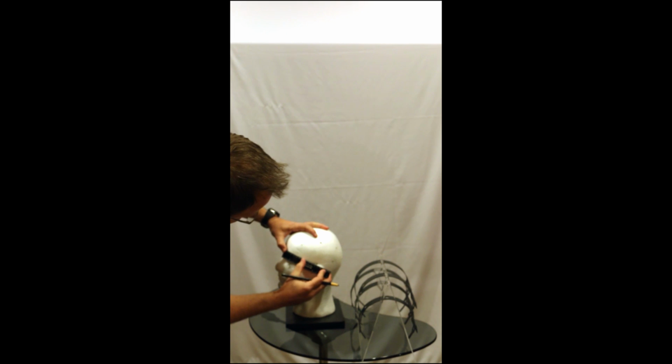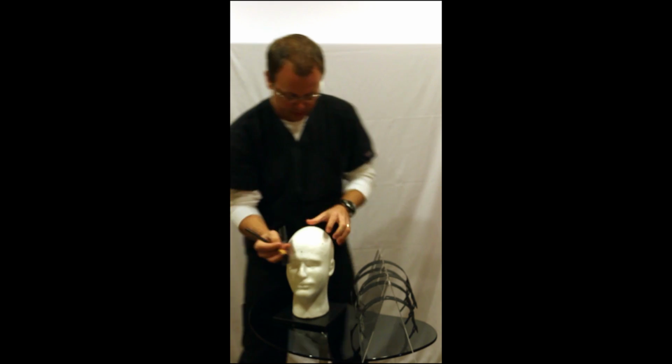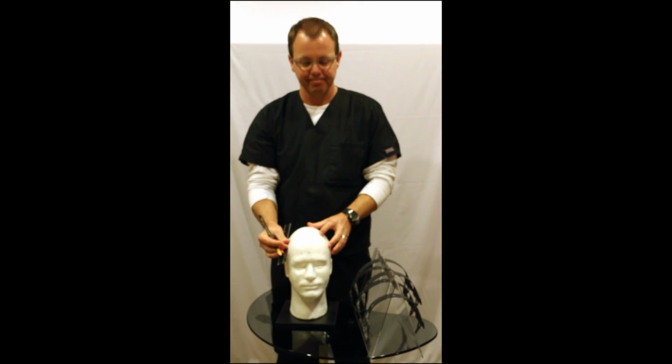From here to here is 11 centimeters, 5.5. And we're done.